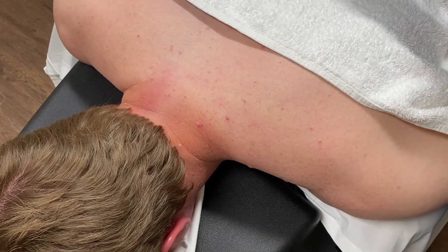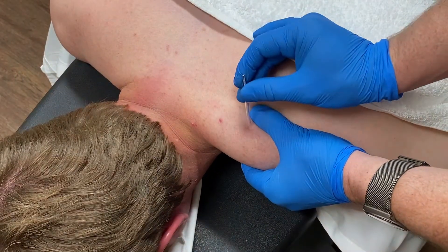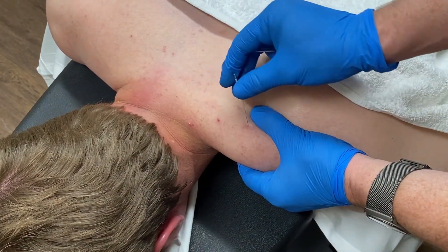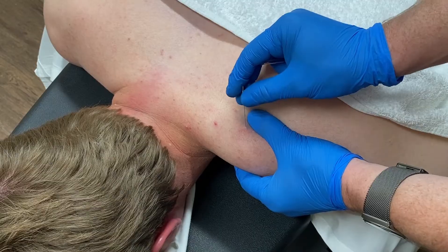Grasp the tissue of the upper trap and pull it away from the chest wall. Insert the needle and angle it to slope away from the thorax and away from the lung field.